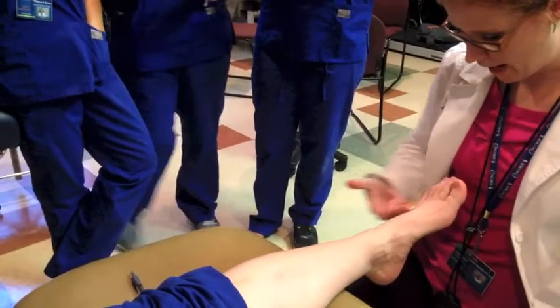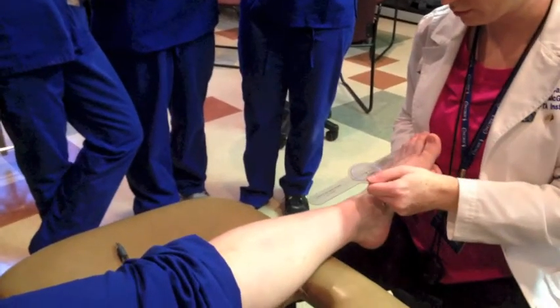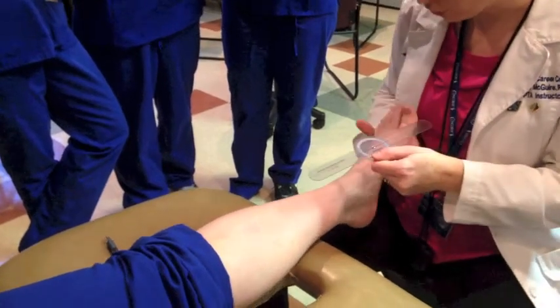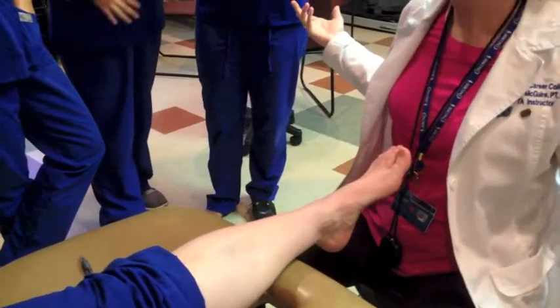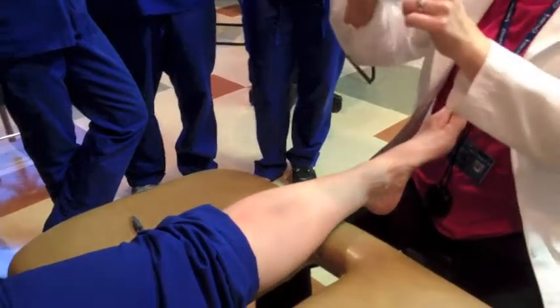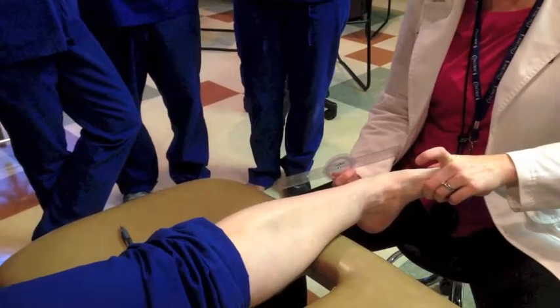So we kind of rest in a little bit of inversion. If she was neutral, everything would line up. But if that confuses you at all — because we're at zero, but she's not resting at zero. I'm just lining up my arms. We're at zero. Let's do inversion first, so I'm gonna invert her.